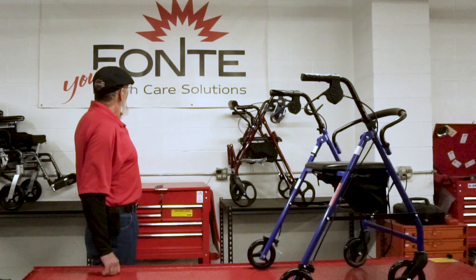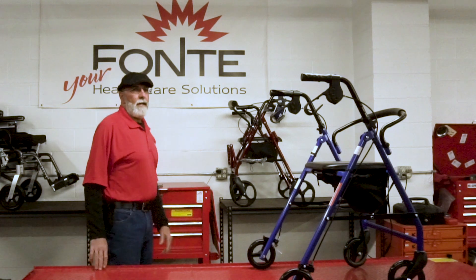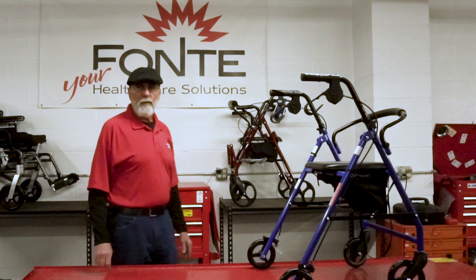Hi, I'm Chris from Fontes, your healthcare solutions company, and today's quick tip is how to adjust your brakes on your rollator.